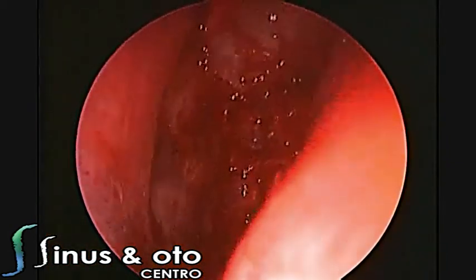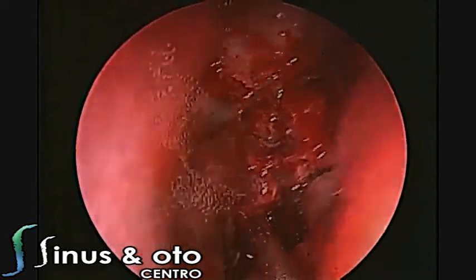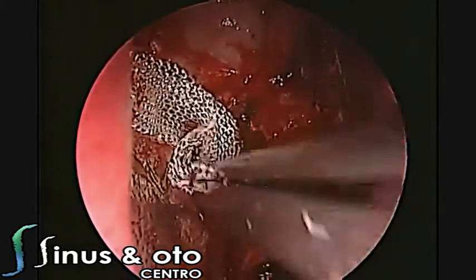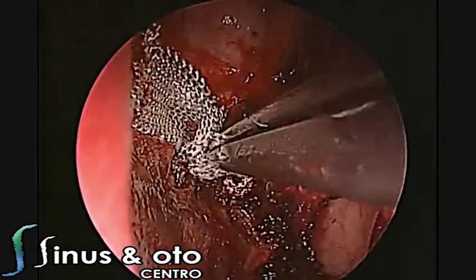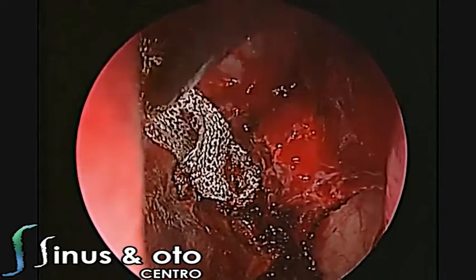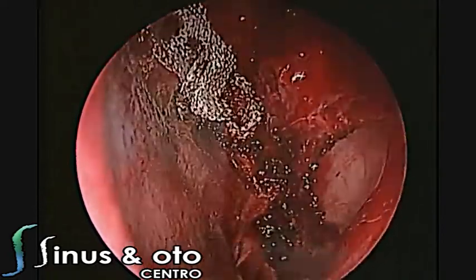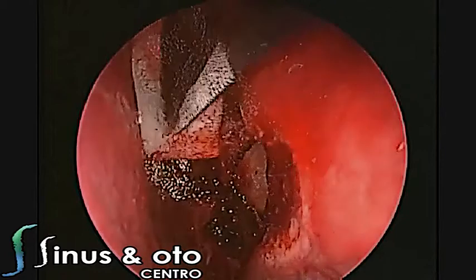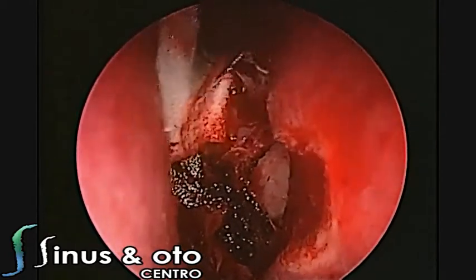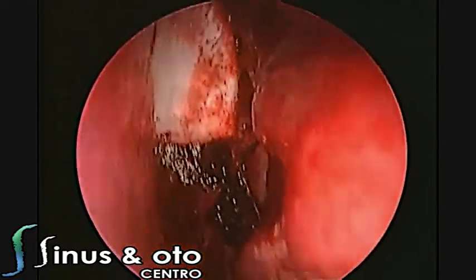Here is the final view. This is the inferior turbinate, the septum, and the mucocele which was marsupialized. Then we place some hemostatic material — this is Surgicel — and then we put a little bit of gelfoam just to assure hemostasis.